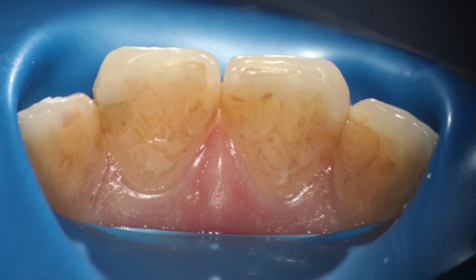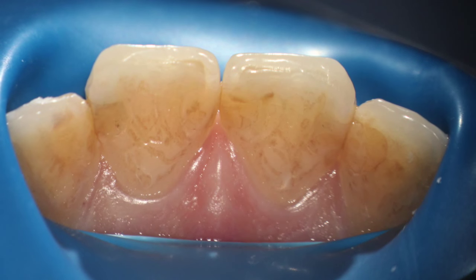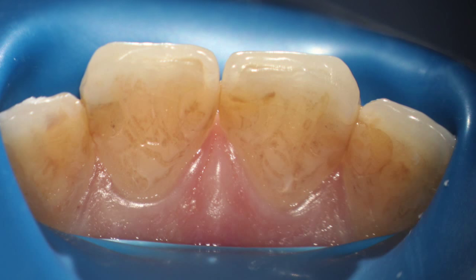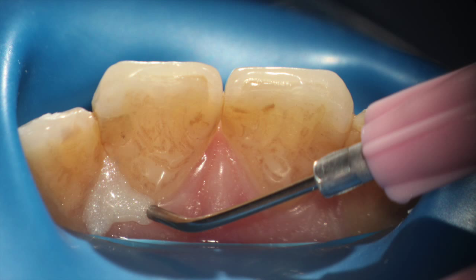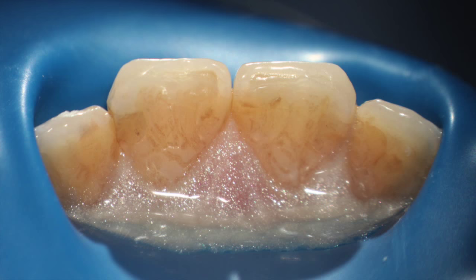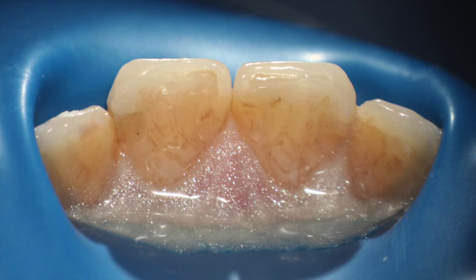What I recommend in these cases is not to access without a rubber dam, but to use a split dam. You can apply the rubber dam in a split dam fashion — whether lateral to lateral or canine to canine — which allows you to also visualize the gingiva, giving you clues for orientation to find the canal. Once access has been obtained and instrumentation has begun, proceed to use other materials such as Opal Dam to cover the gingiva, providing a good secondary isolation for proper microbial control during your actual instrumentation and procedure.